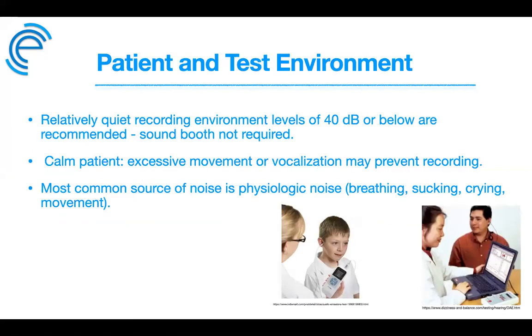Okay, so the patient environment. Based on a study done by Rhodes in 1998, we know that continuous background noise in excess of approximately 50 to 55 dBA should be avoided, because it reduces the OAE signal-to-noise ratio and reproducibility. We want a relatively quiet recording environment of 40 dB or below. A sound booth is ideal, but it's not necessary. You can do just fine without it.